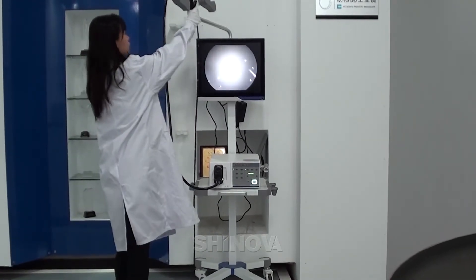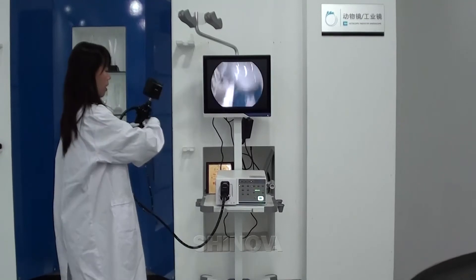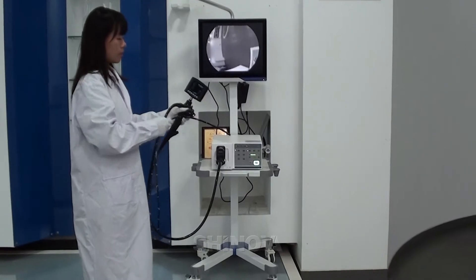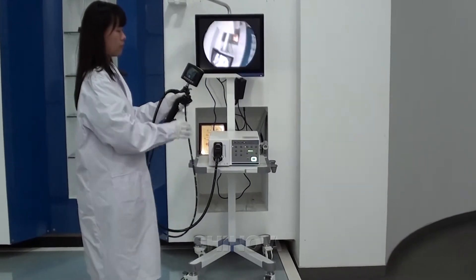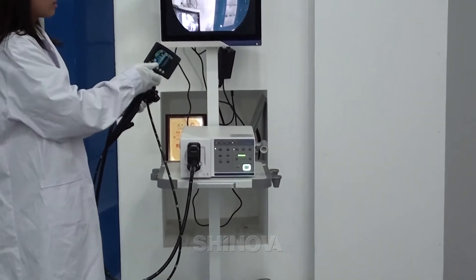For this Innoscope, we have a 3.5-inch monitor like this. Many doctors, when they do have the procedure, can use this monitor. It's very convenient for them.